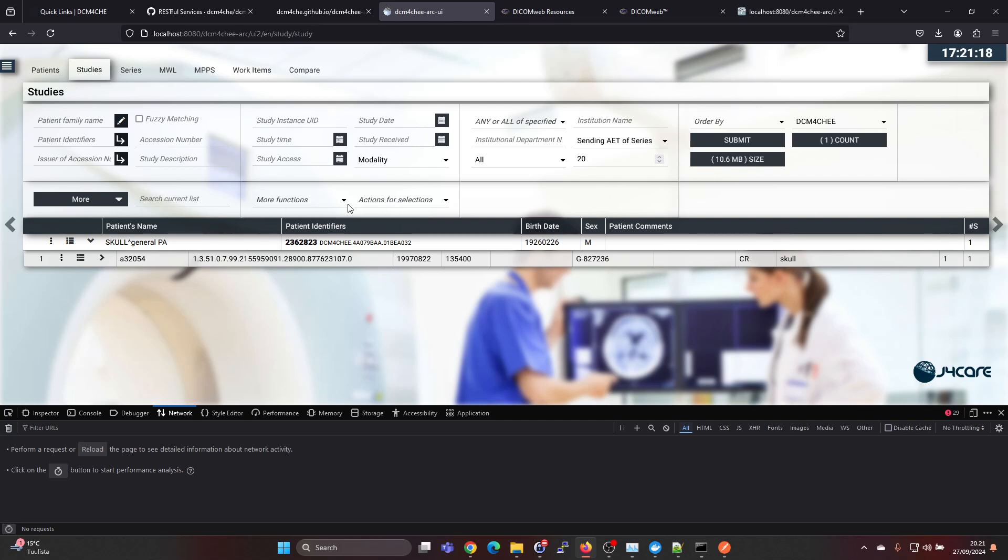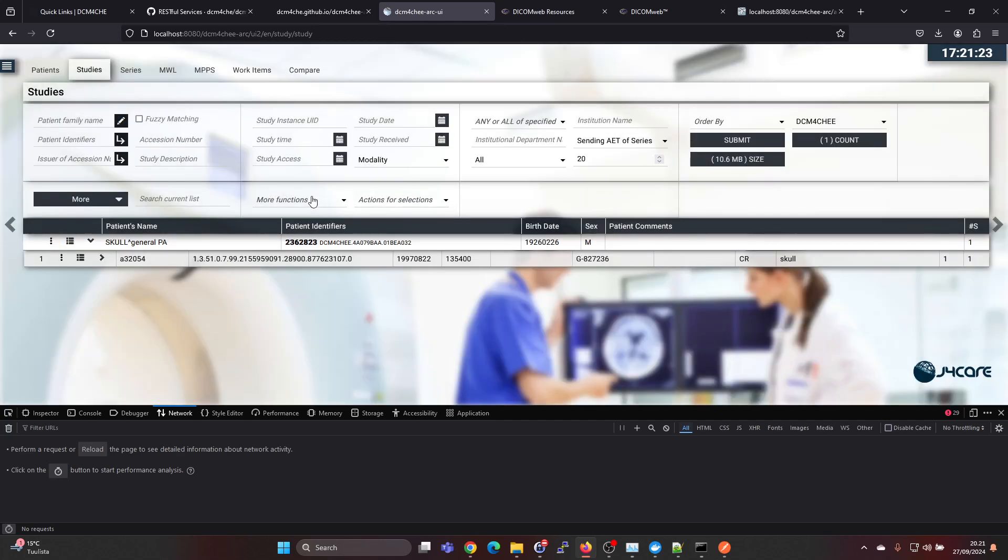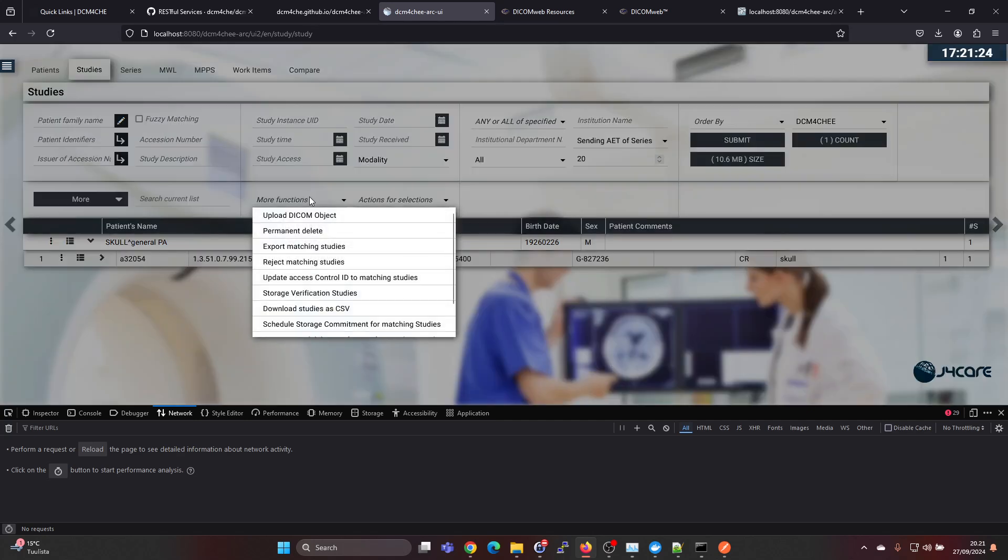Here in the studies view we have actions for selections, no sorry, more functions. Here we have upload DICOM object.